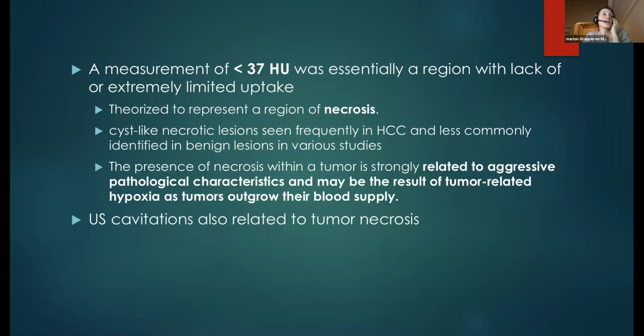The presence of necrosis is strongly related to aggressive characteristics and can of course be the result of tumor-related hypoxia, as the tumors outgrow their blood supply, so they become necrotic. Same for the cavitation that we can see on ultrasound, which was related to tumor necrosis.